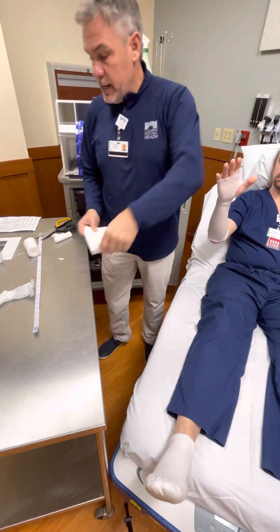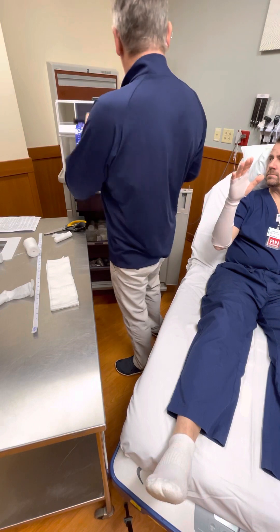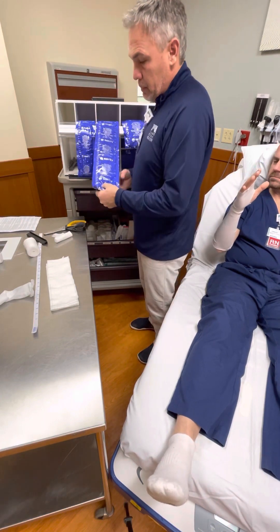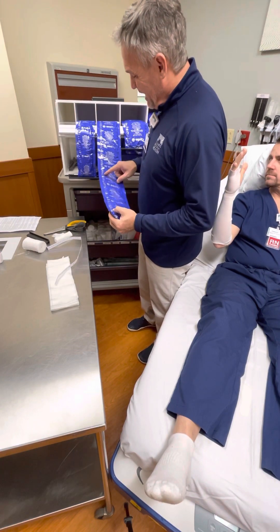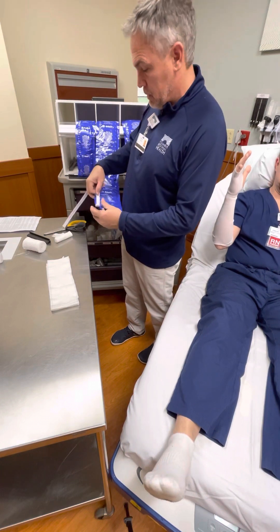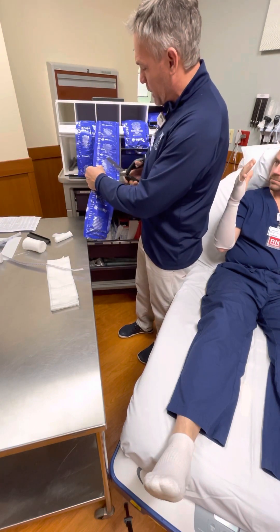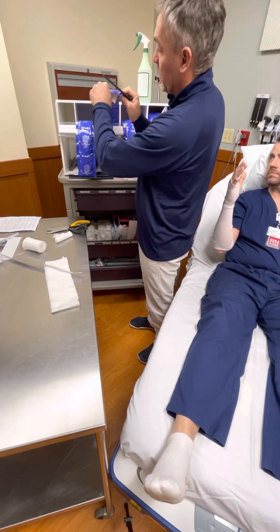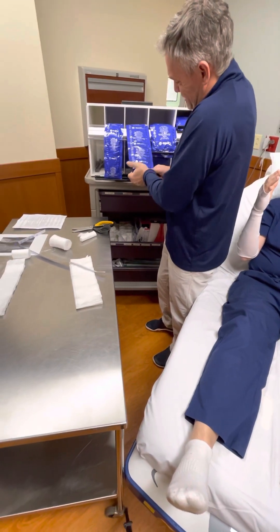I have this material ready and now I'm going to get my casting material ready. I'll use the three inch in his case - it's easier to see. Just a volar splint. It's going to be about 12 inches long - these have markings on them you can use, though I wouldn't rely on them too much, it's not perfect science anyway. So 12 inches to here - cut a little bit extra. As soon as you cut that, first thing you want to do is tuck the material back down inside and use the clip to put it back on that way so the rest of it's not ruined.